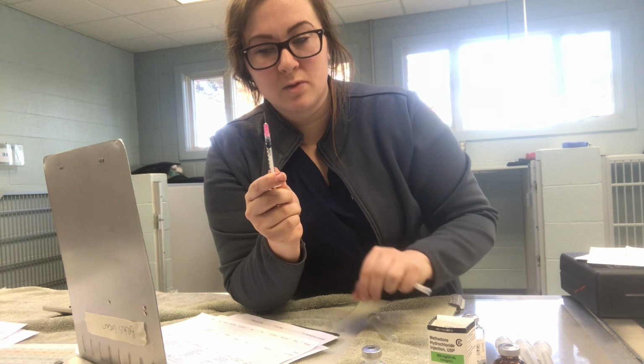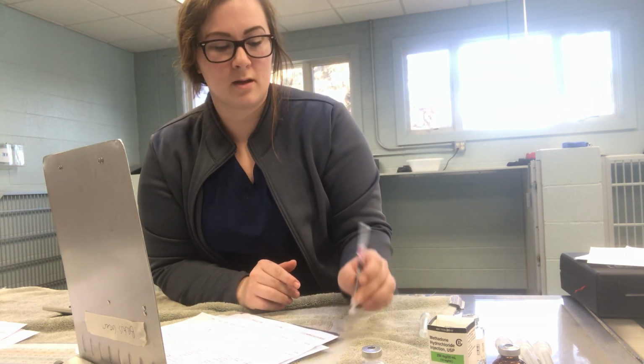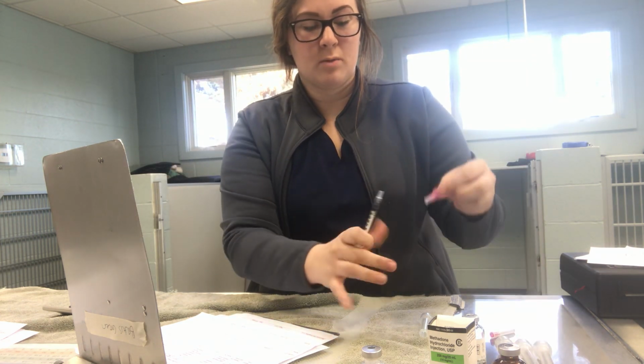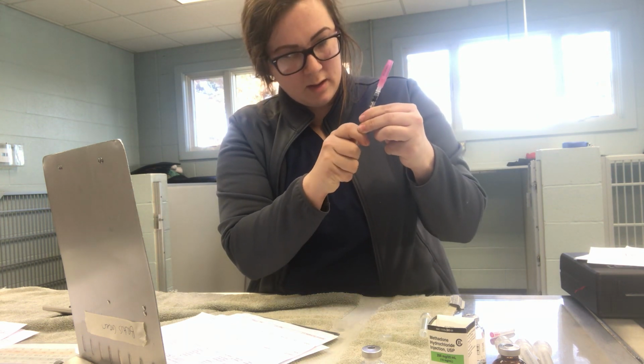And I'm just going to draw back because we are going to change the needle on this. So we're going to do the one-handed method. Draw back so we don't waste any in the hub. Remove that. And we're going to place our new 25 gauge needle on there and then inject up.